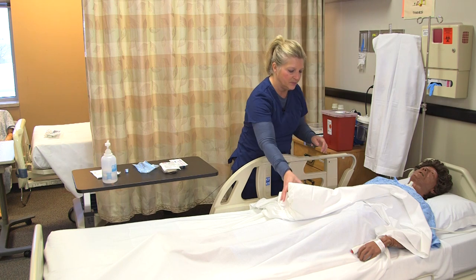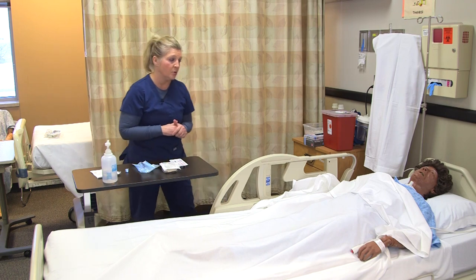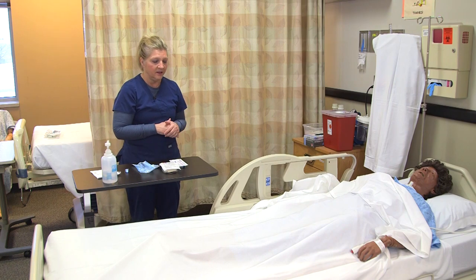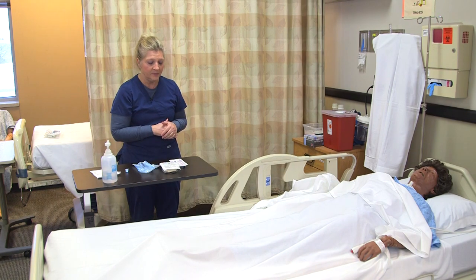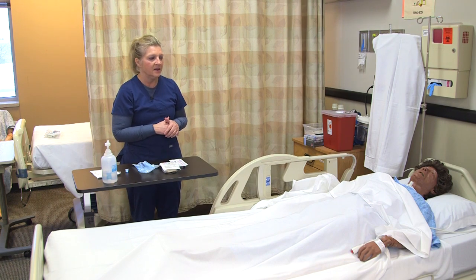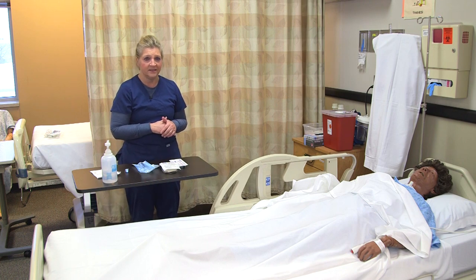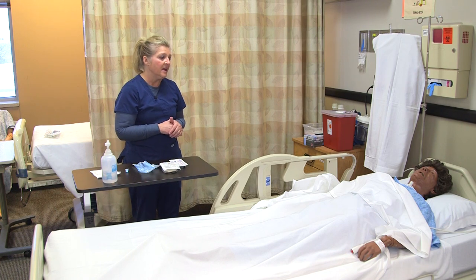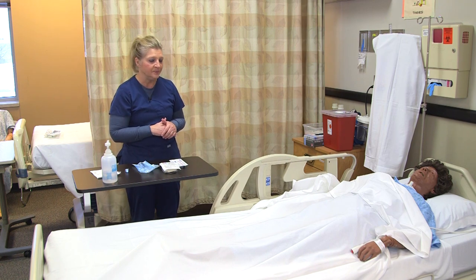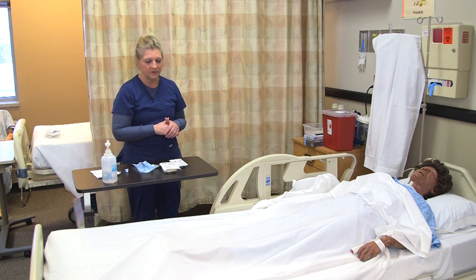Once you determine you have the right patient, review the practitioner's order or prescription in the EMR. Once you verify the prescription, look at the patient's indication for having the IV started. In this case, the order is for an IV saline lock for giving IV antibiotics and other medications. The patient will not have infusing IV fluids at this time.